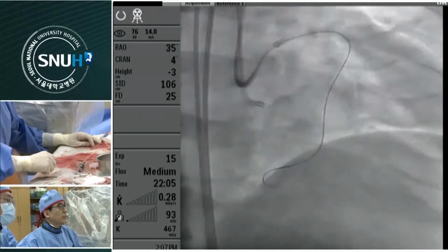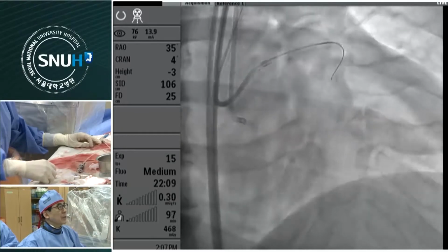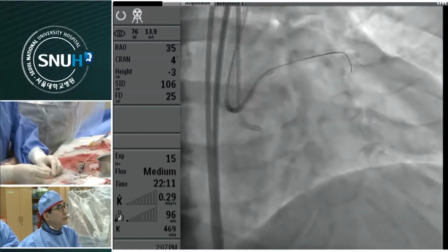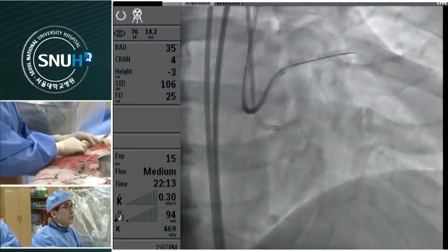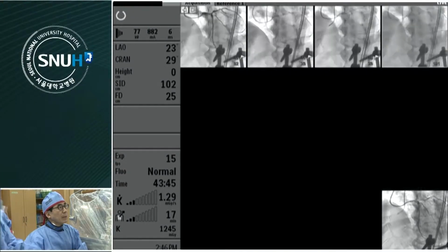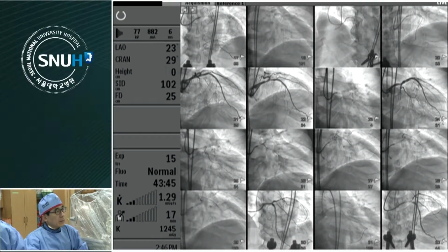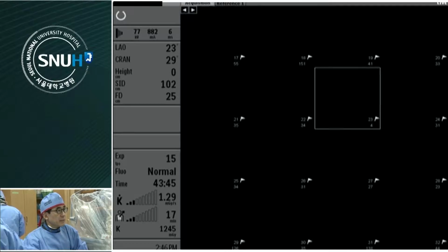I'd like to remove Dr. Kim's collateral from the first septal because of the acute angle; it is impossible to reach the final destination. With the advice of Igarashi, I switched the retrograde approach from septal to circumflex epicardial collaterals.